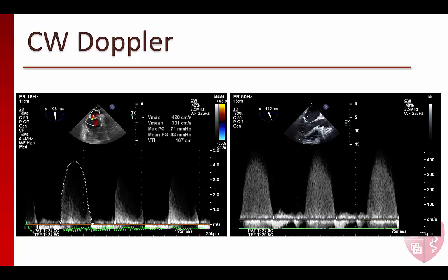The timing of the signal is also important. A more triangular signal with an early peak is indicative of either elevated left atrial pressure or severe MR. Note that while it is possible to underestimate MR if the CW signal is not directly aligned through the vena contracta, it is impossible to overestimate severity using this technique. As is true for other methods of assessment, interpretation of the continuous wave signal density and contour is of limited value with eccentric jets.